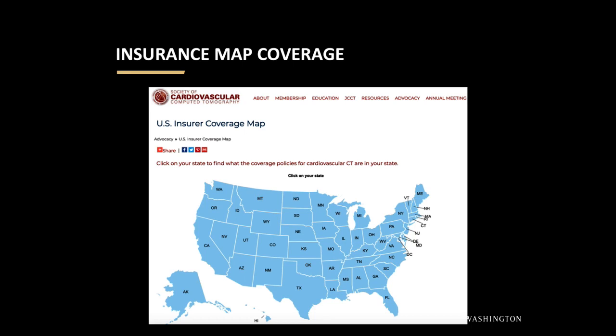Another interesting approach that is done in other places is doing a coronary calcium scan prior to the CTA to help triage. This is just a non-contrast scan with low radiation, sort of a scout film. It would be a way to triage patients: if your coronary calcium score is above 400, maybe CTA is not the best test for you. If you have a really low calcium score, then they would proceed to the CTA. That's one way I've seen done clinically, as opposed to age. But again, that would have patients undergo an additional upfront scan to make that call.